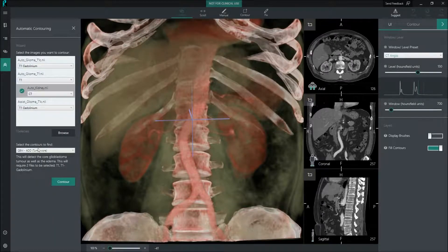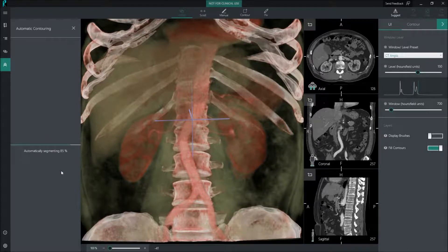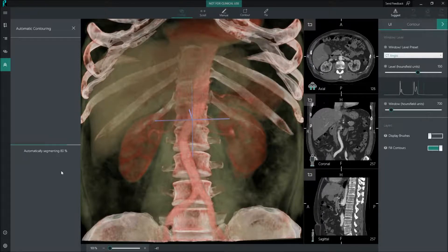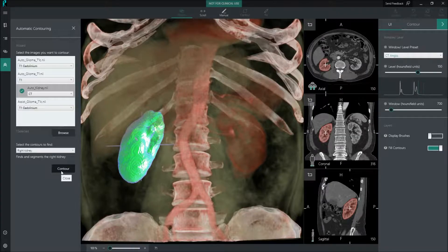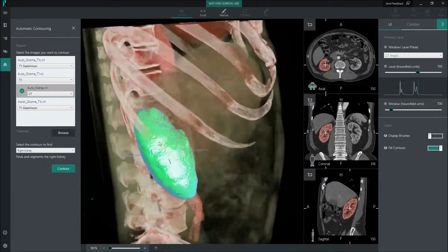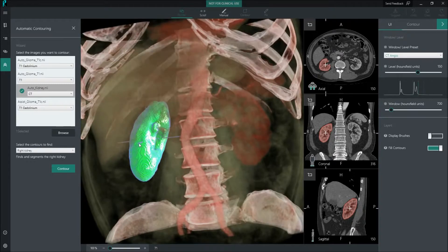Here, we apply the same machine learning model on a CT scan. We have loaded another decision forest that was trained on recognising kidneys and it is running now in the background. Just like before, every voxel in the image has been classified as belonging to the organ of interest — in this case the kidney — or everything else, the background. The segmentation here is obtained completely automatically in just a matter of seconds.